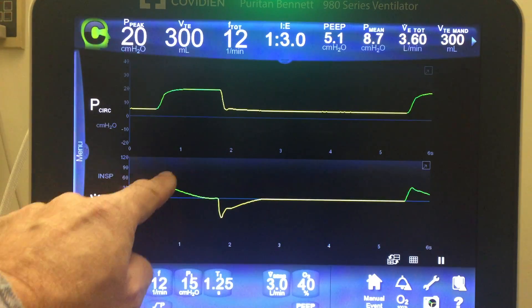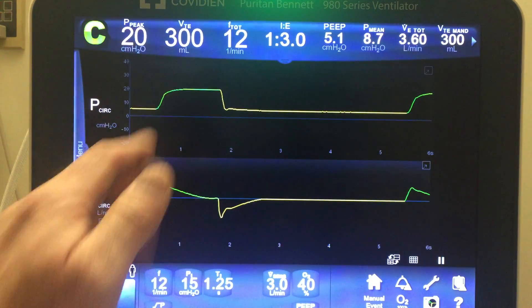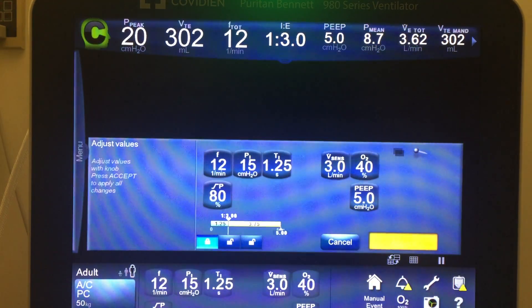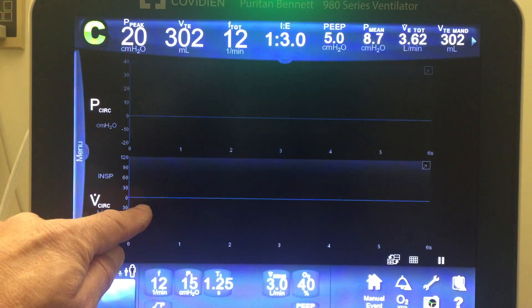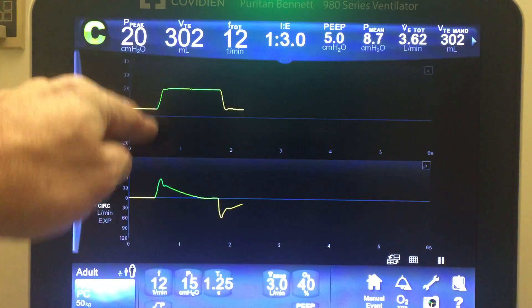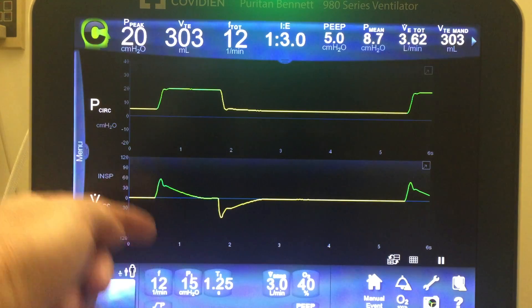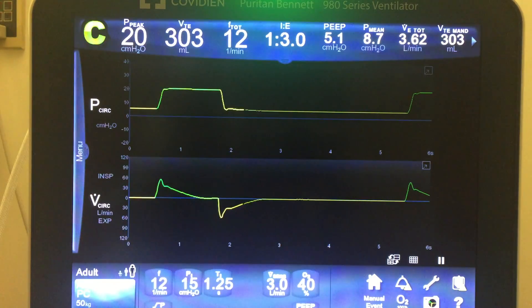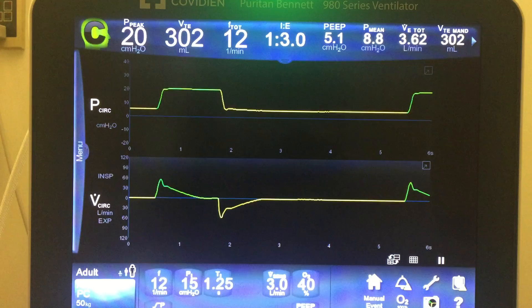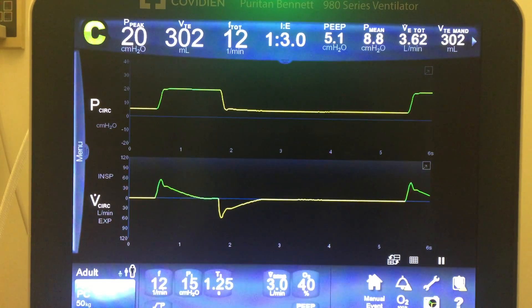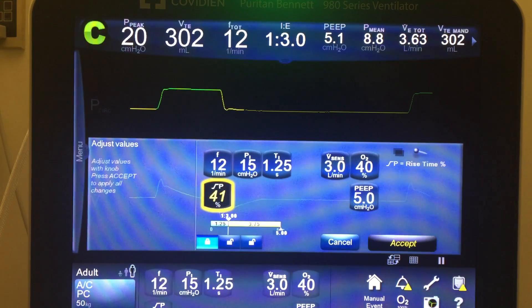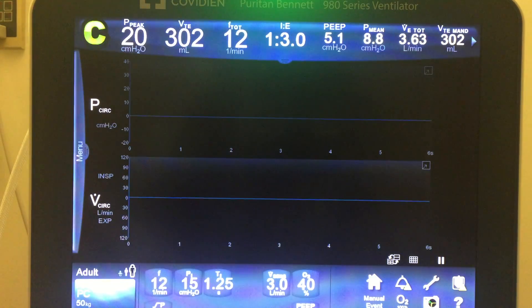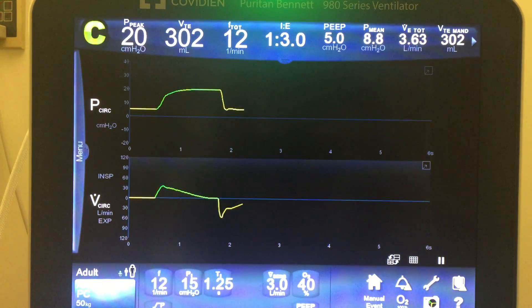Notice how the waveform is kind of laid down — it's a slow acceleration. This button right here is flow acceleration. If we roll that up, it will actually reach the peak pressure faster. Watch — this waveform is going to stand up a little more. It does create a little spike, which is not desirable because that spike is going to make it meet pressure sooner. This is a little much. But if your patient is a little air hungry, you can increase that value to make them more comfortable. When would you want to use a lower value? Well, if they have a lot of airway resistance, you might use a lower value so that it's a more gentle flow on the lungs and doesn't create as much pressure.